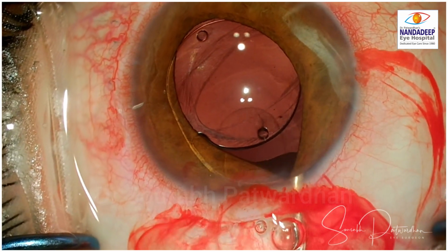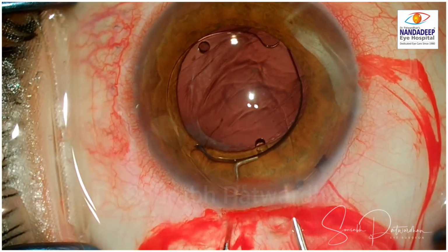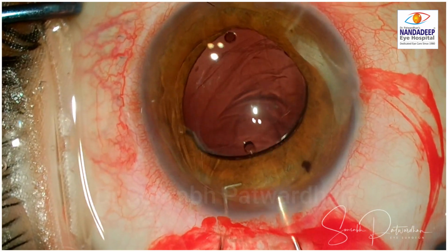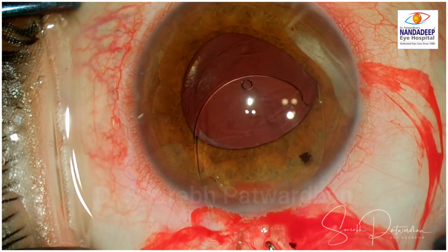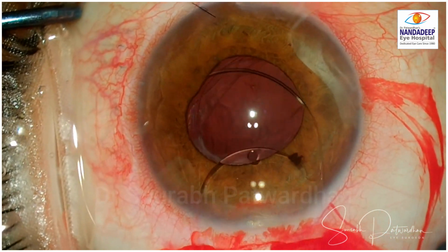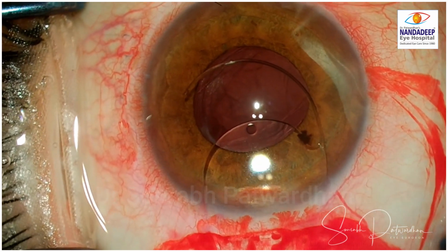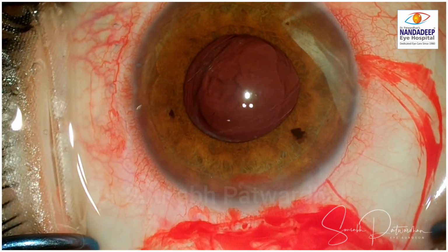The patient was quite worried about the glares, and so now this is the method to remove the IOL from the anterior chamber. One Sinskey hook underneath the IOL optic and another Sinskey hook was pulling the IOL out. This way you avoid it getting stuck in the incision or avoid getting iris incarceration while removing the IOL.